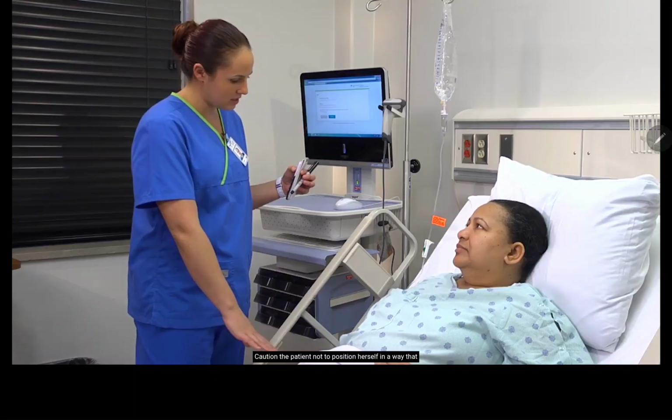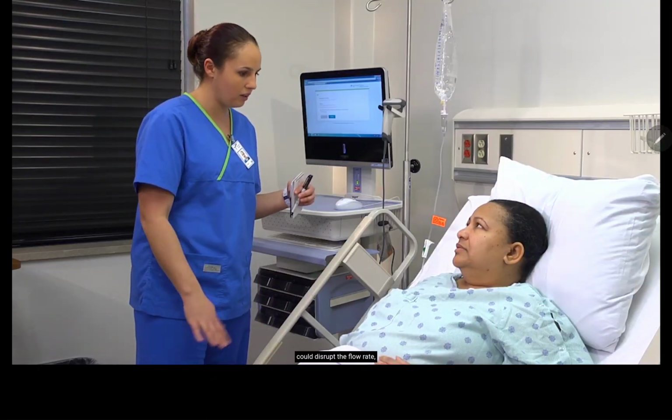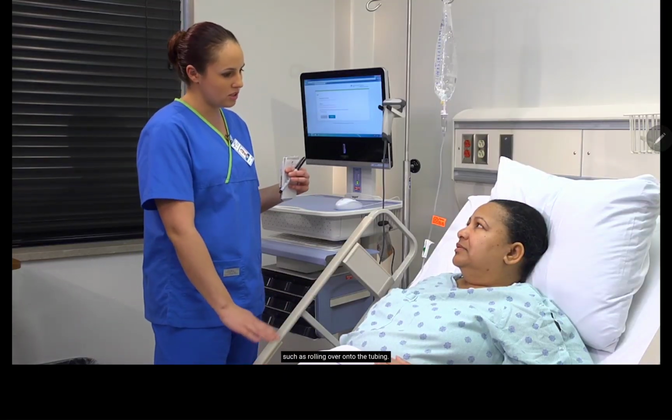Caution the patient not to position herself in a way that could disrupt the flow rate, such as rolling over onto the tubing.